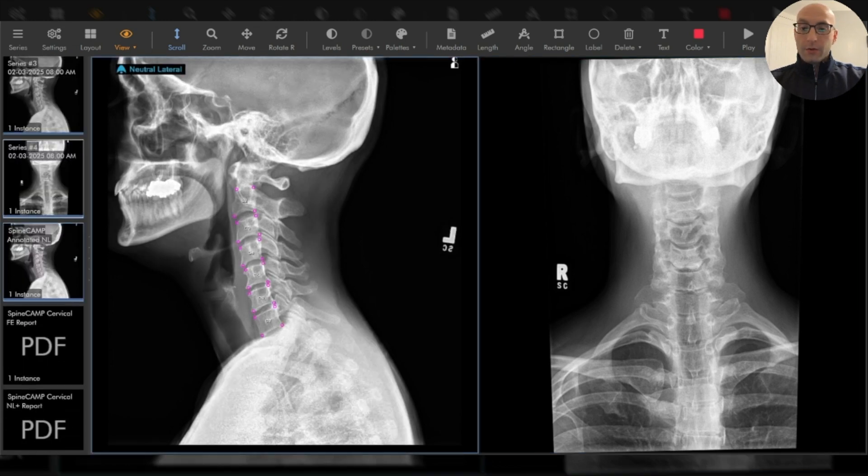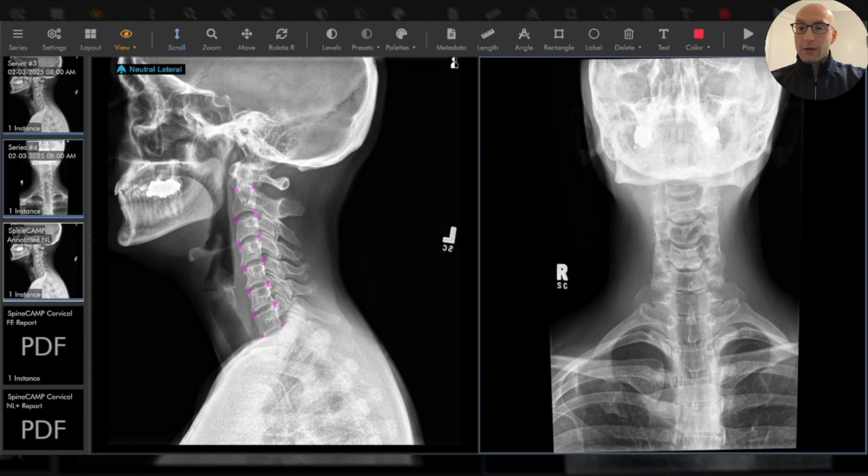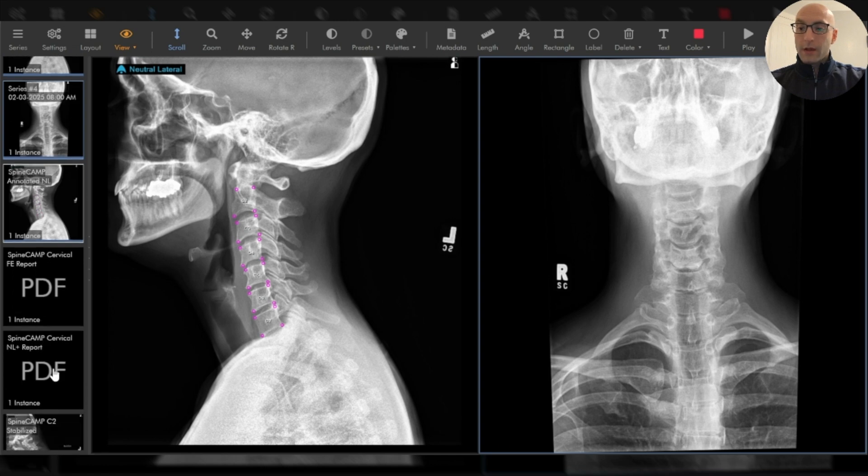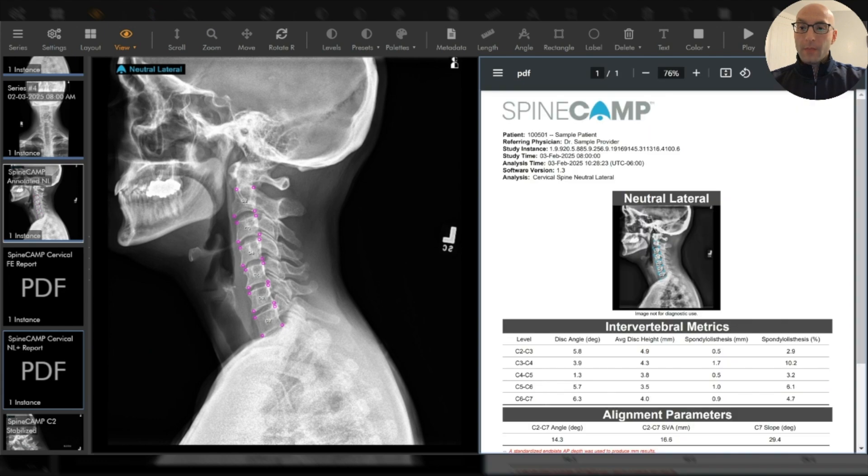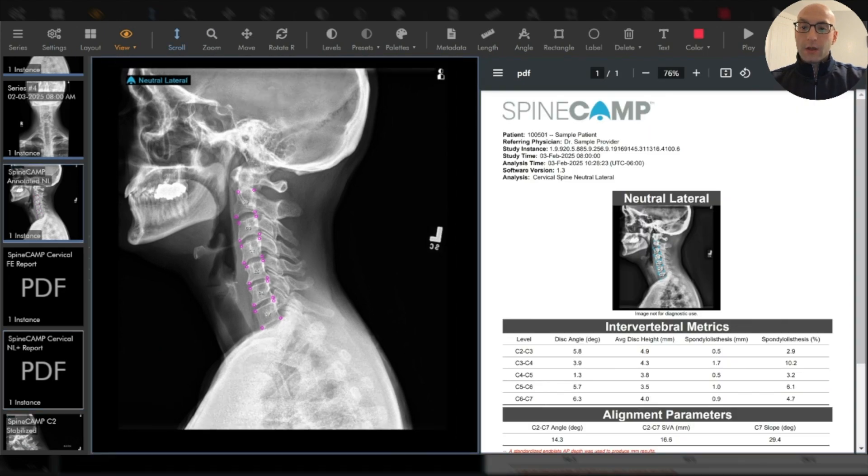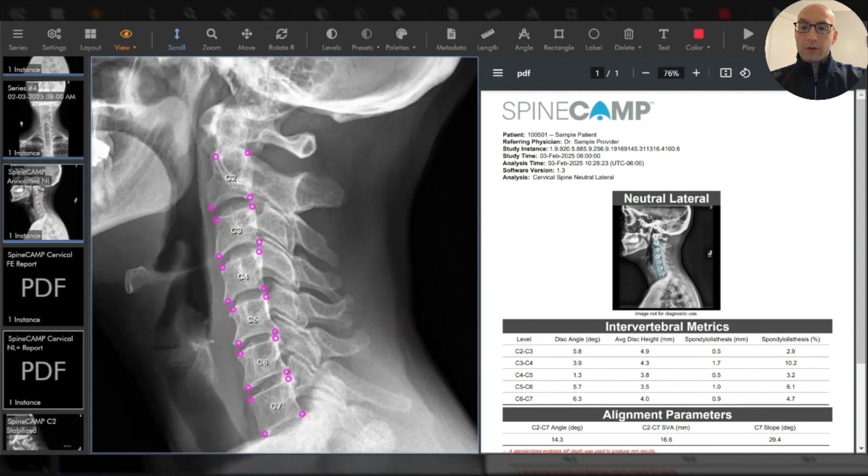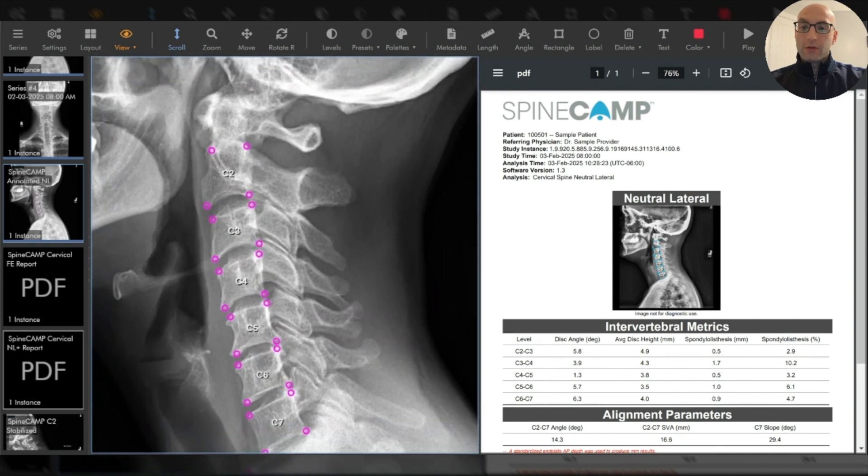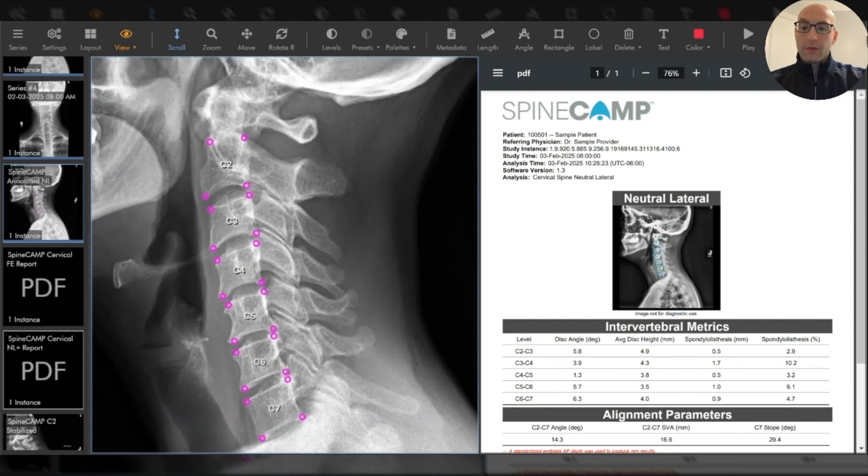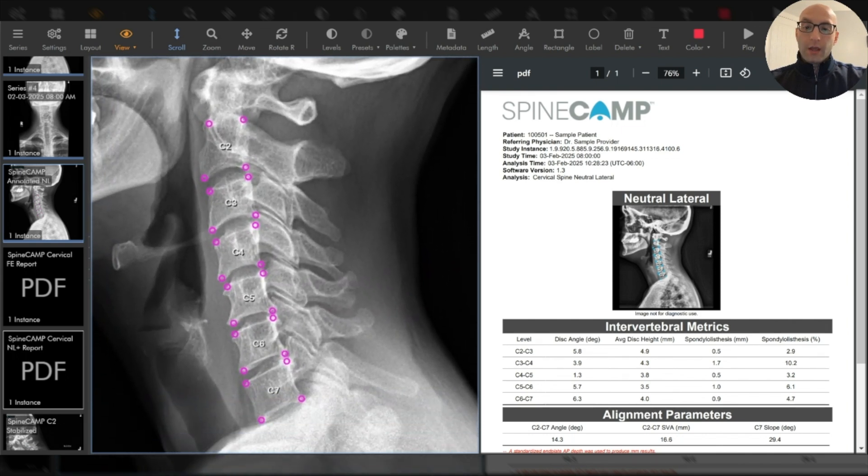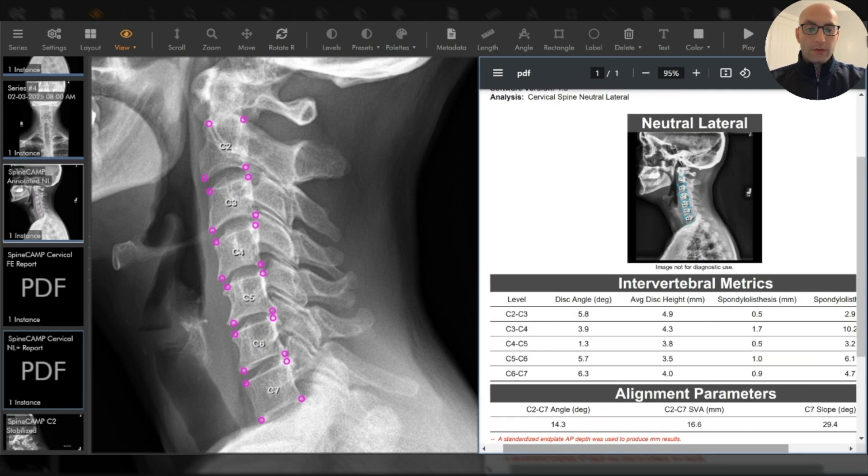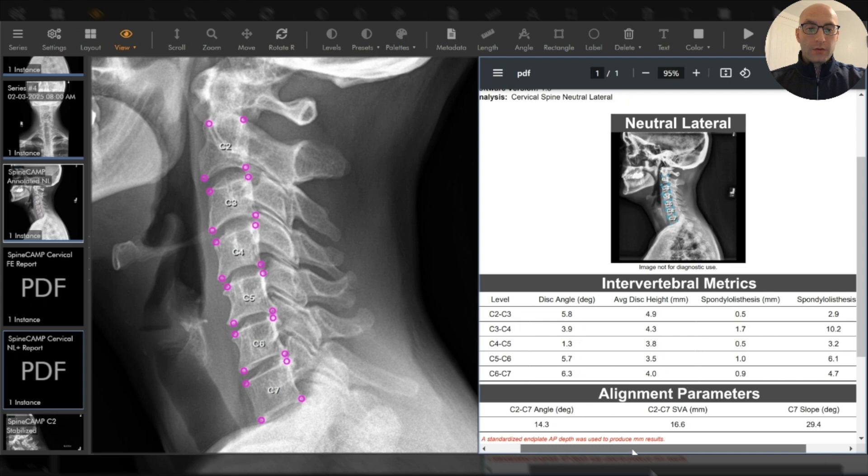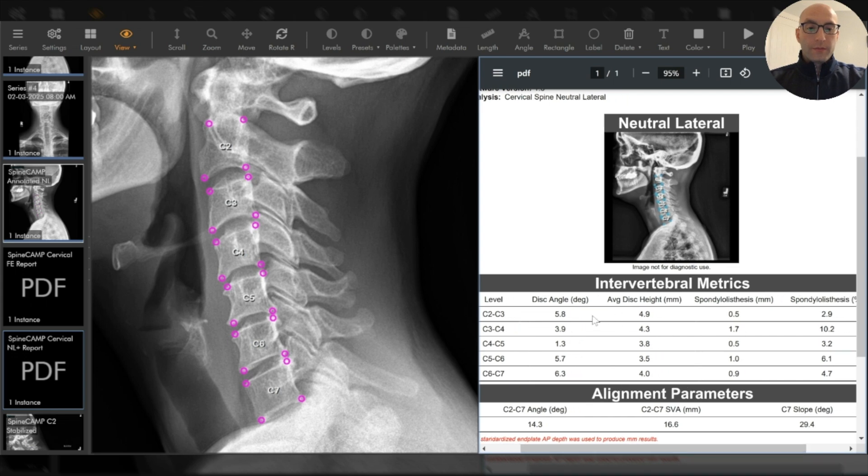On the left I'm going to pull in an annotated neutral lateral done by the AI and on the right I'll pull in the respective report. You can see that the AI labeled the neutral lateral imaging and all the vertebral bodies from C2 to C7. It also landmarked those and those landmarks are used to give you accurate and reliable measurements of spinal alignment as you can see over here in this report.